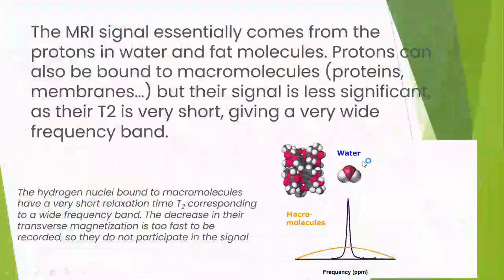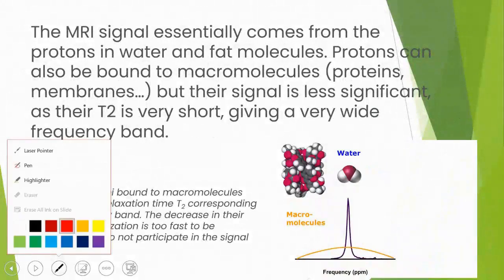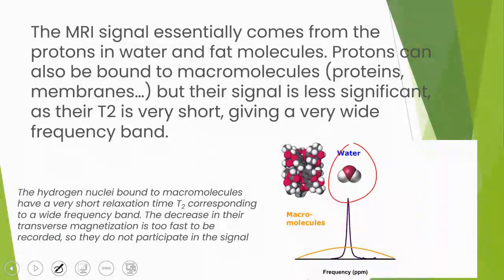We talked about the difference between fat and water, how significant this difference is, and why we understand it. This is because the structure of fat is different from the structure of water, and the movement of the molecules of water is different from the movement of the molecules of fat. There is a difference in frequency between fat and water. The hydrogen atoms present in water resonate at a frequency higher than the hydrogen atoms found in fat, approximately by 220 Hertz, if I am working at 1.5 Tesla.